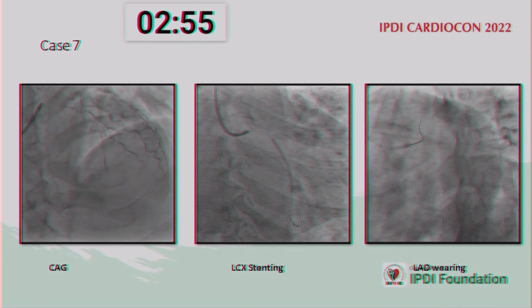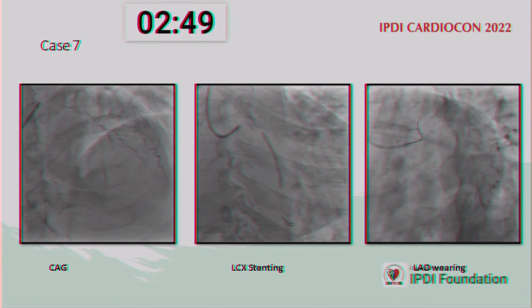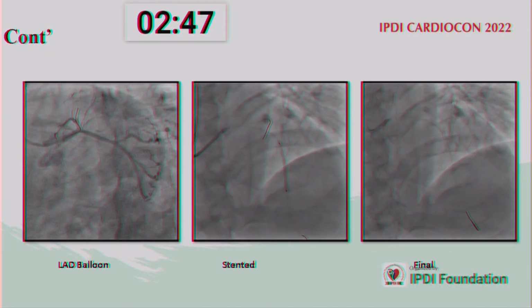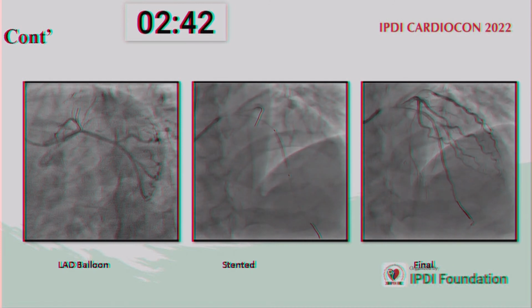And this is another case where LM to LAD, LCX and LAD is done in this same distal radial approach. On the right panel, the final result.